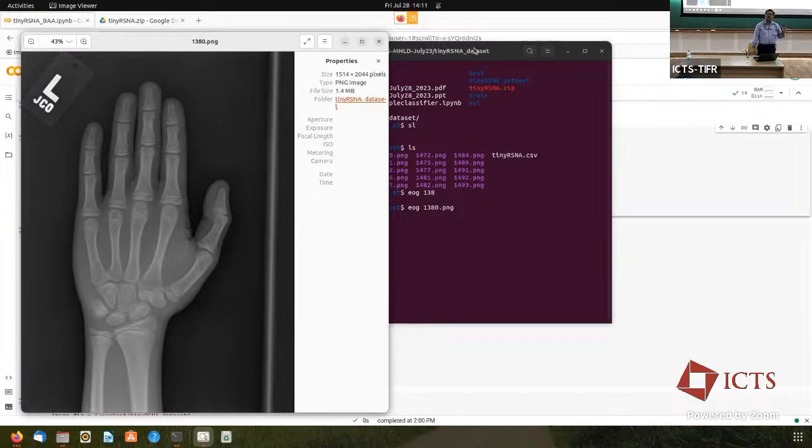How many people know what I'm talking about? Convolutional neural networks. Most of you know. I'll give you a 2-minute overview of what a convolutional neural network is. Basically, a convolutional net takes in an image. Remember, I talked to you about images as being arrays of pixels. When you pass that array of pixels into an input layer of neurons, it will pass it down through successive layers.